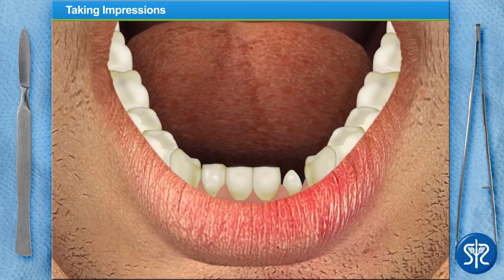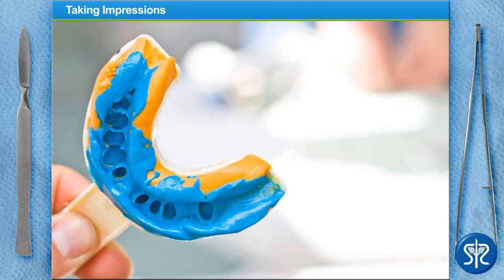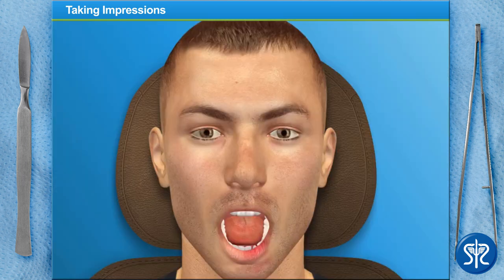Now that the tooth has been shaped, we'll need to take impressions of our patient's teeth. This is done by placing impression trays into the mouth and having the patient bite down on them. These trays are filled with a putty-like substance generally referred to as impression material. The impression material is used to create a plaster cast, which is sent to our dental lab where a dental technician will make the patient's permanent crown. Go ahead and make the impressions — when you're done, my dental assistant will create the plaster cast and send it to the lab.